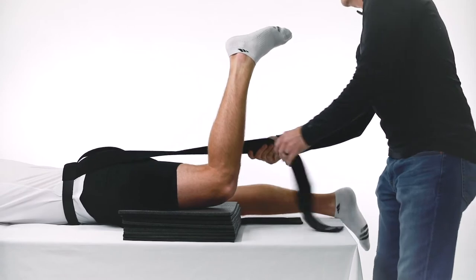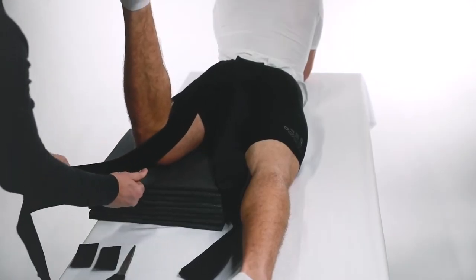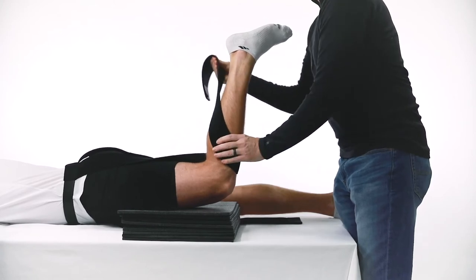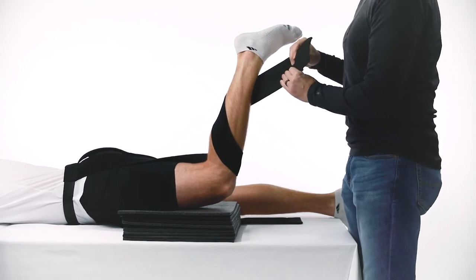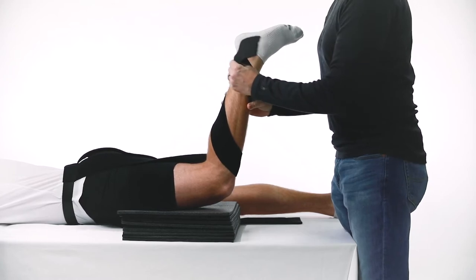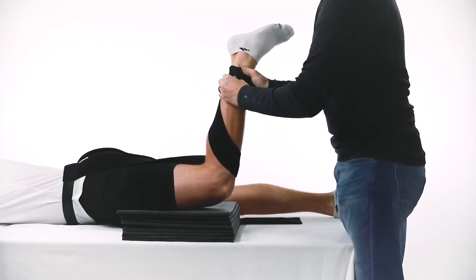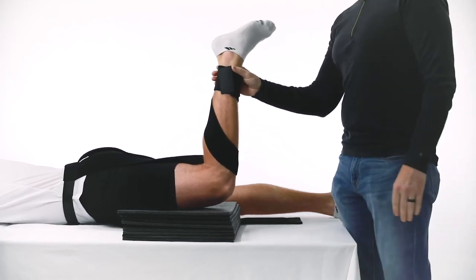Pull strap B toward the medial side of the shin of the affected leg, crossing the affected hamstring. Pull strap B tight to remove slack and create tension. Pull strap B across the anterior of the shin just below the kneecap, then continue spiraling strap B down the lower leg, securing the strap around the ankle with the attached hook and loop fastener, cutting off excess material of strap B if necessary.